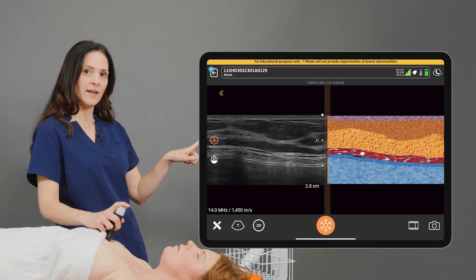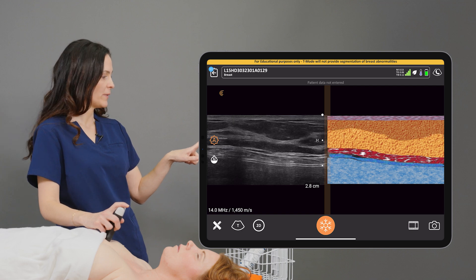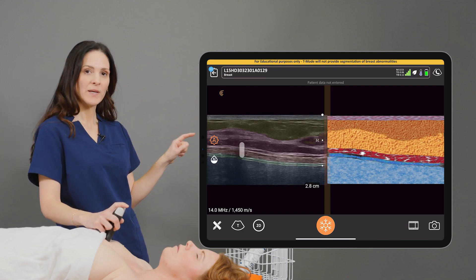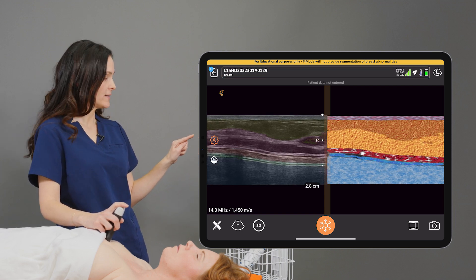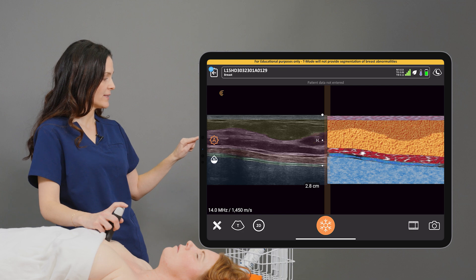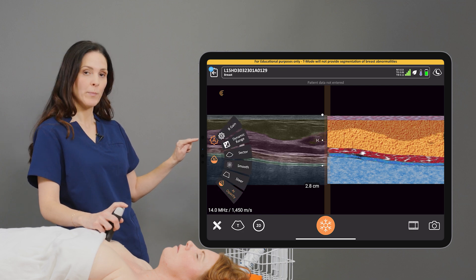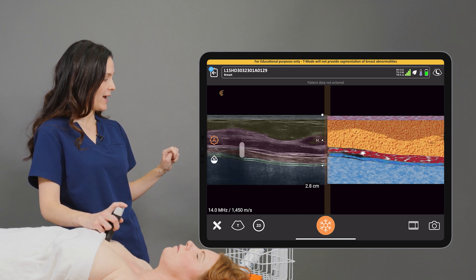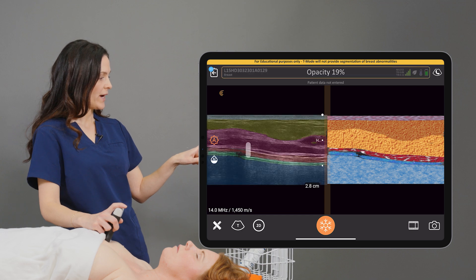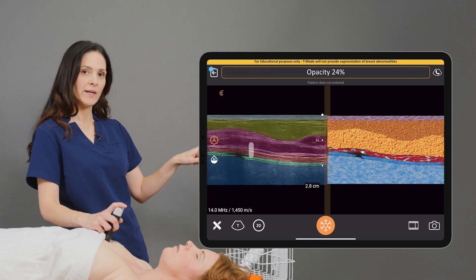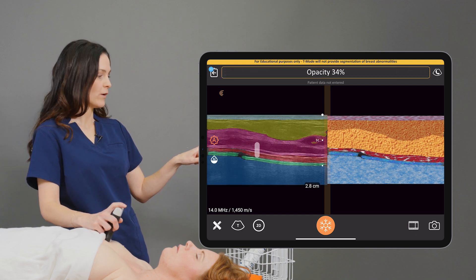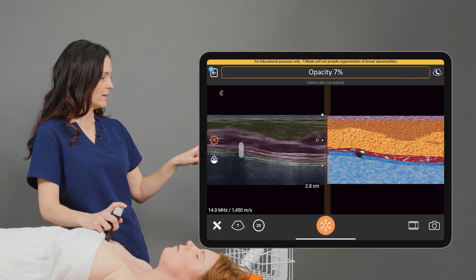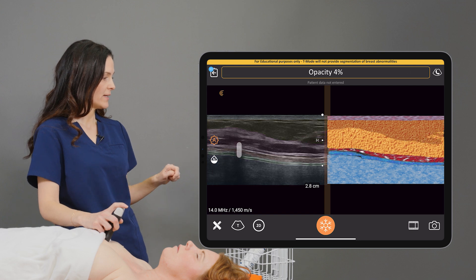On the left-hand side of the grayscale image, we can adjust the segmentation opacity by selecting the AI teardrop icon and selecting AI opacity. When we drag our finger to the right on the screen, the opacity is increased, and to the left, the opacity is decreased.